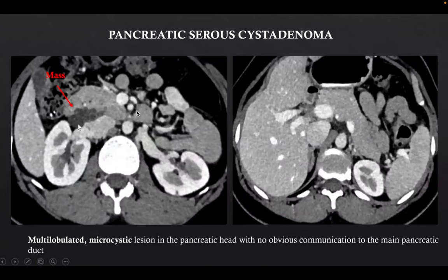This was a case of pancreatic serous cystoadenoma. We can see a multilobulated microcystic lesion in the pancreatic head with no obvious communication to the main pancreatic duct.